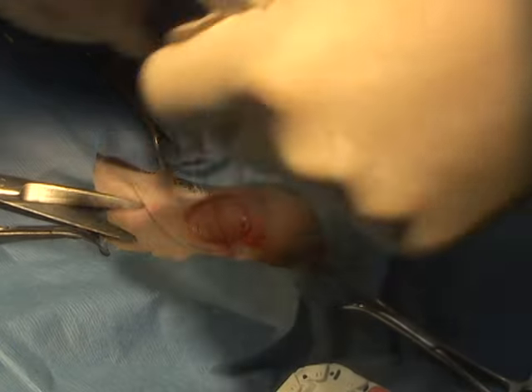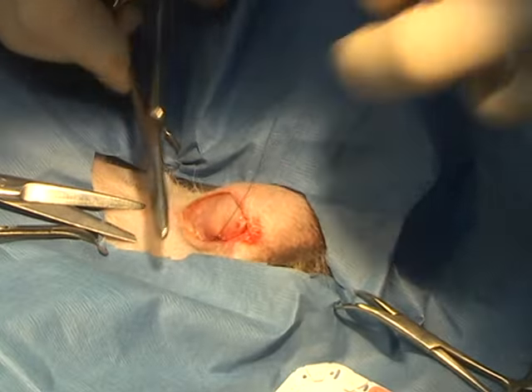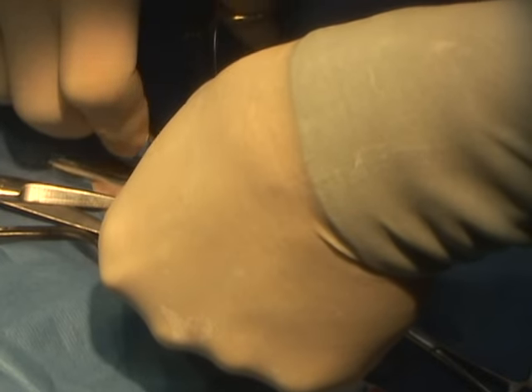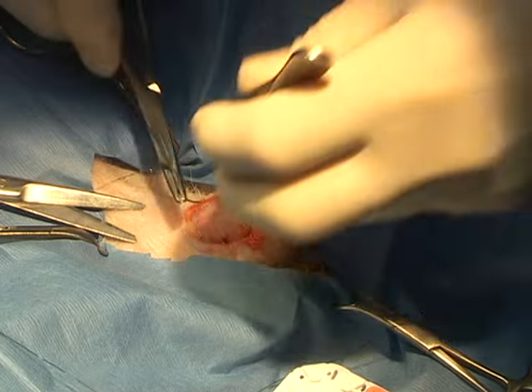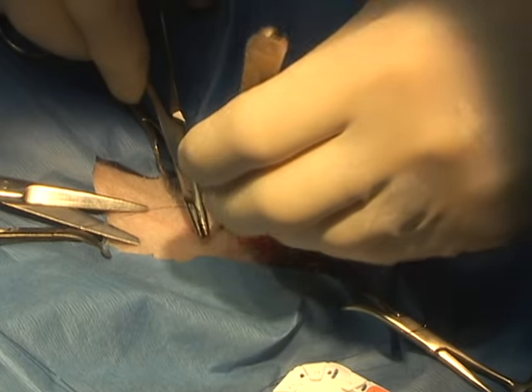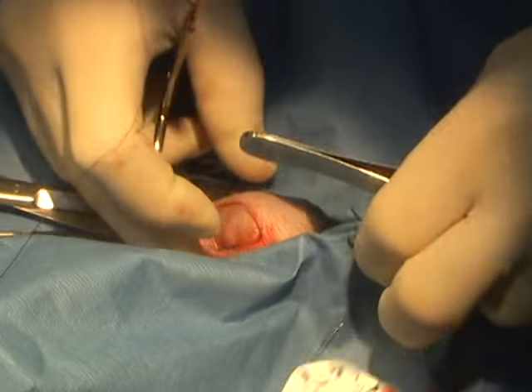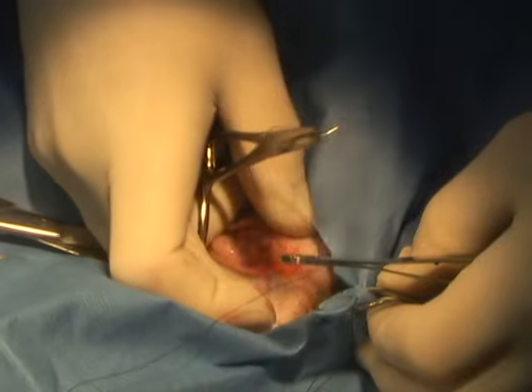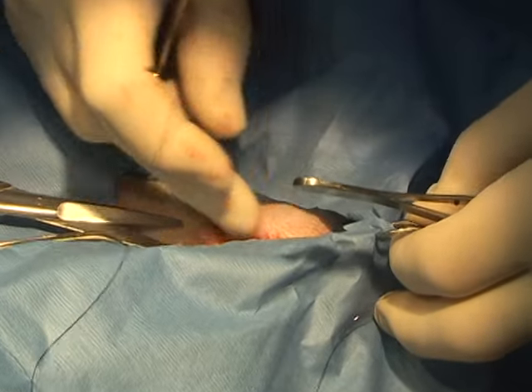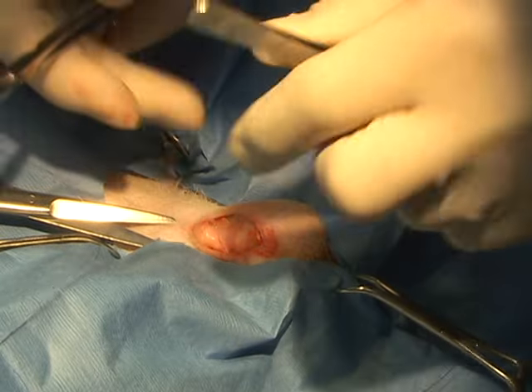At no time was the dog uncomfortable with the procedure. We did not have to use a cone. We usually have e-collars waiting just in case there's any issue with this, but in this case, the dog didn't care at all. The difficulty over the next several days was to keep him quiet, because we did not want to get more edema in the area because he was active. You can see we're trying to move the left testicle back down in the scrotum, and it just didn't want to go back in because of the edema.